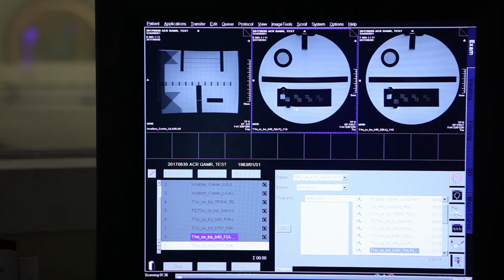Now, important thing is that if I reverse the polarization of the gradient, they go the other way around. That's a very, very important issue there. The one which looks down should go higher up. So there are a lot of things you can check with this small phantom. This is very important.